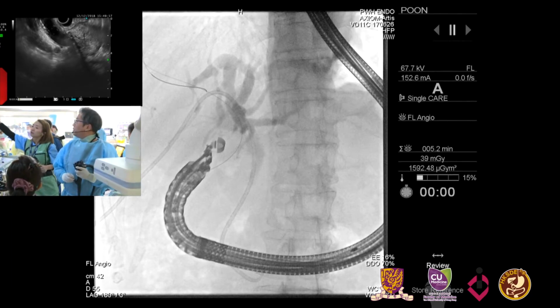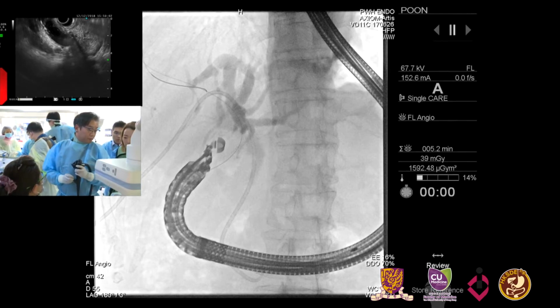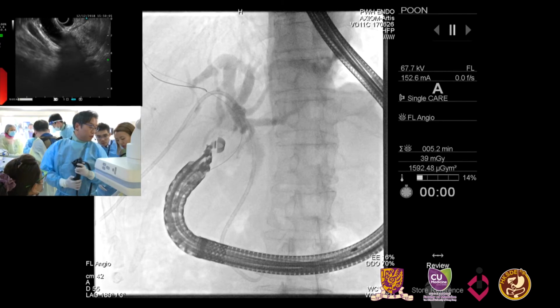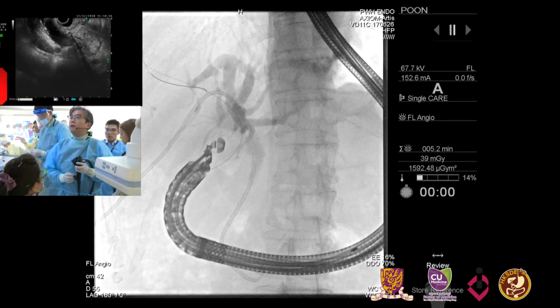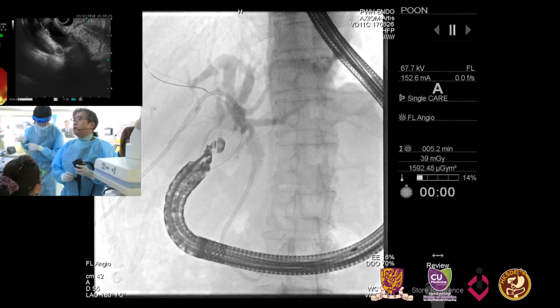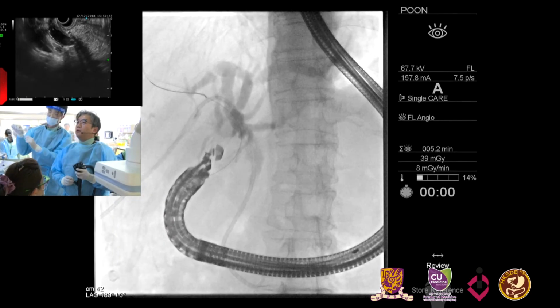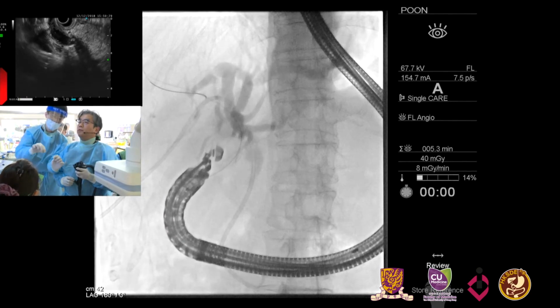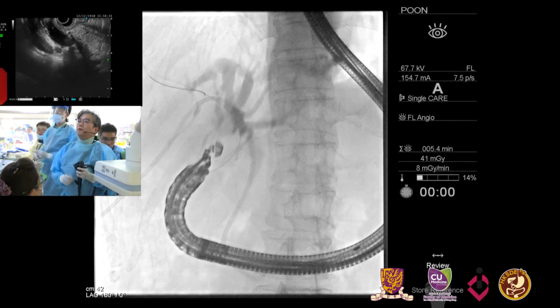Well, the published data shows very good outcomes, but they're all at expert centers and they're not that many numbers. They've also compared EUS-guided biliary drainage versus PTBD in a meta-analysis that showed a little more favorable outcomes with the EUS-guided approach. It's not a matter of just the short distance. You don't have anything to seal off any leak in this area because you're not going through liver parenchyma. So it is very high risk, but obviously he's making it look very easy.